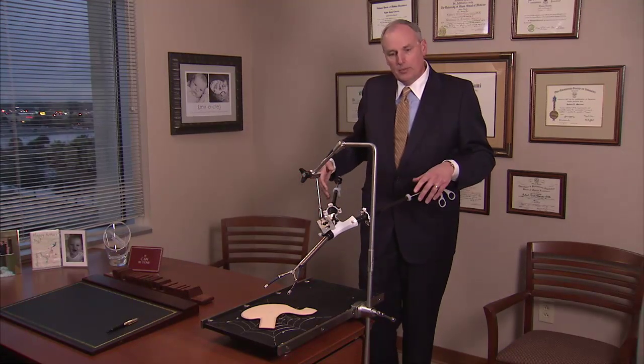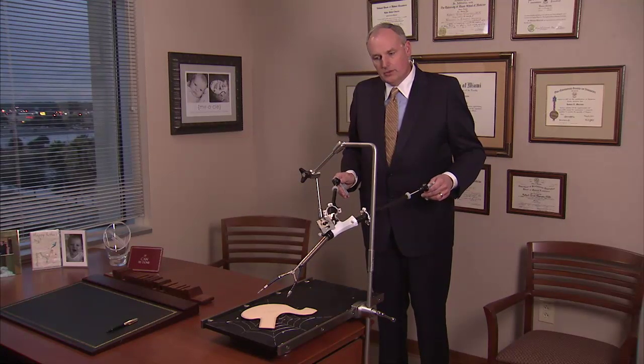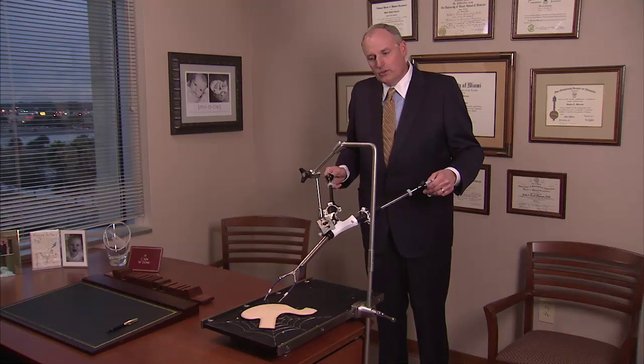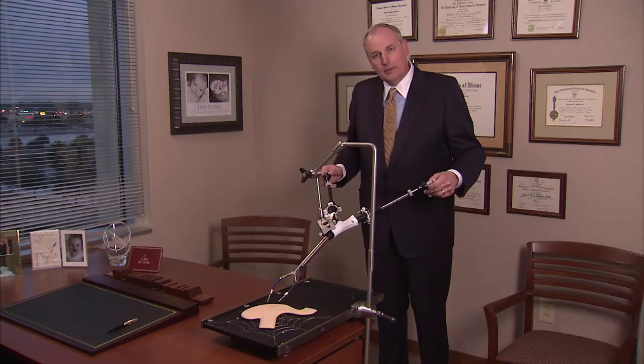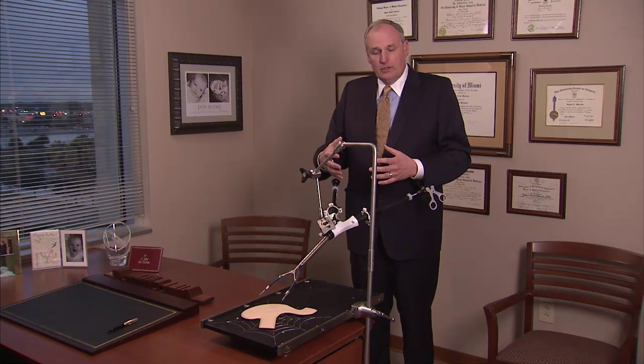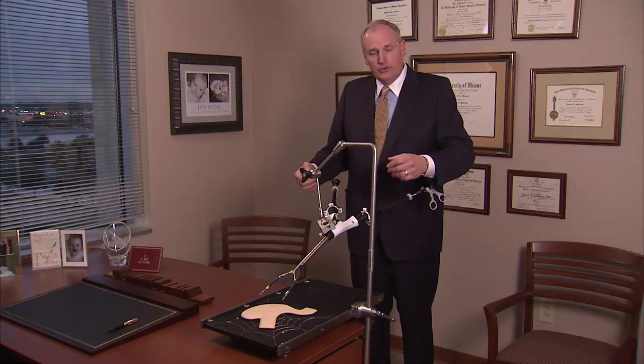Once these mechanical arms are opened, I'm able to insert long skinny instruments through these arms and to control those arms from the outside of the abdomen. That affords me the ability to perform this operation without having to make multiple holes in your abdomen.